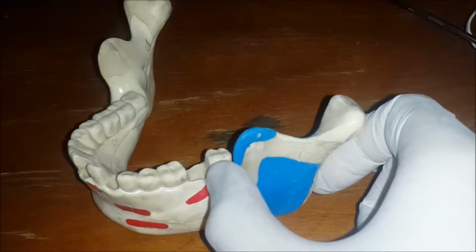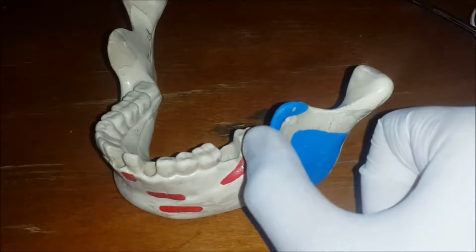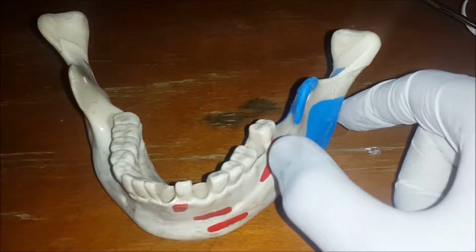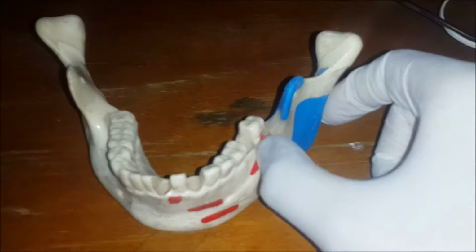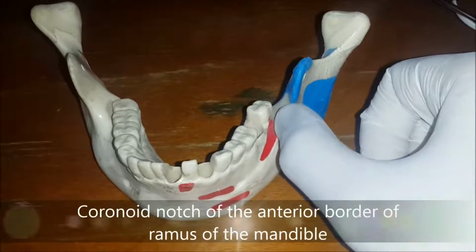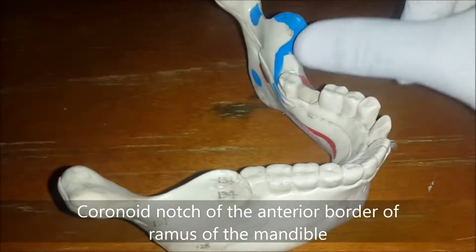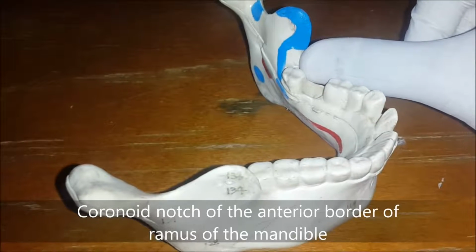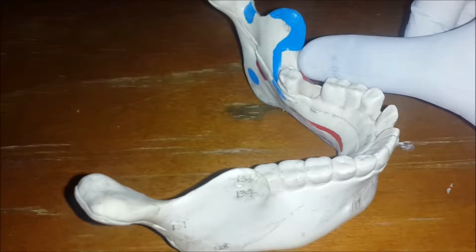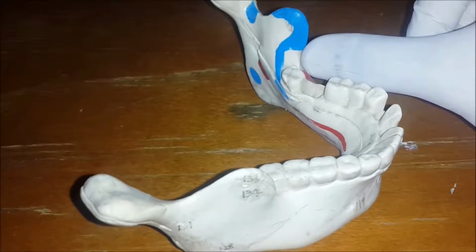This is the ramus of the mandible. This is the anterior border of the ramus. The anterior border of the ramus features a concavity. This concavity is called the coronoid notch. We start our block by identifying this coronoid notch by means of the thumb. The height of the injection coincides with the midpoint of the fingernail.